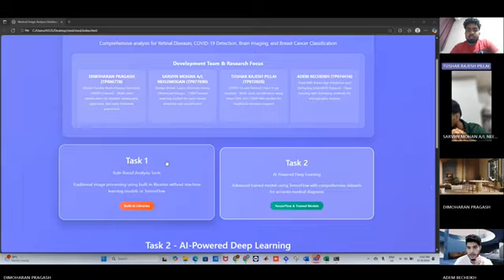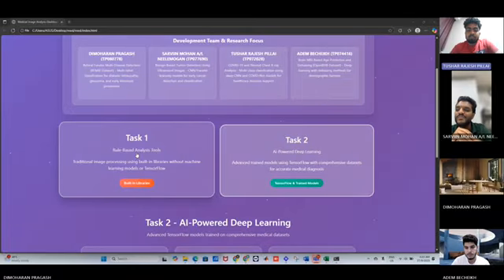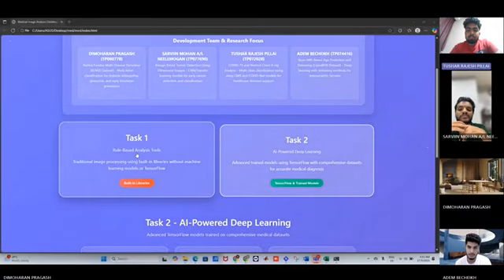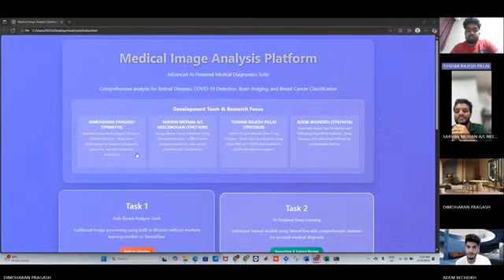So, concluding, COVIDNet offers a strong foundation for automated COVID-19 detection from chest X-rays. Combined with our GUI, the system demonstrates potential for aiding clinicians or for screening in constrained settings.